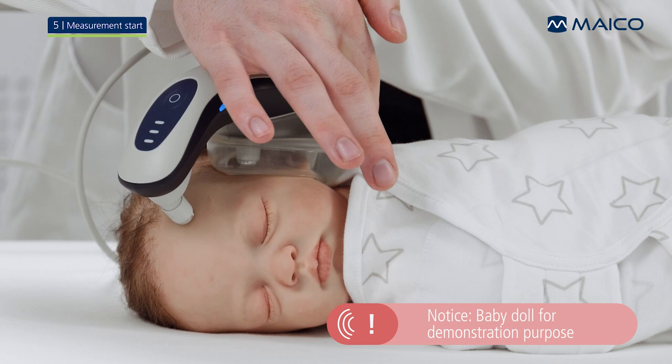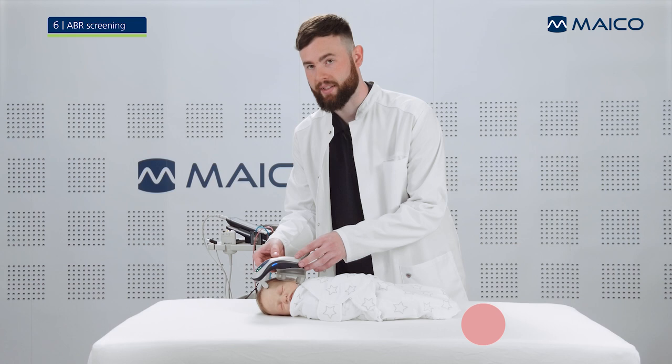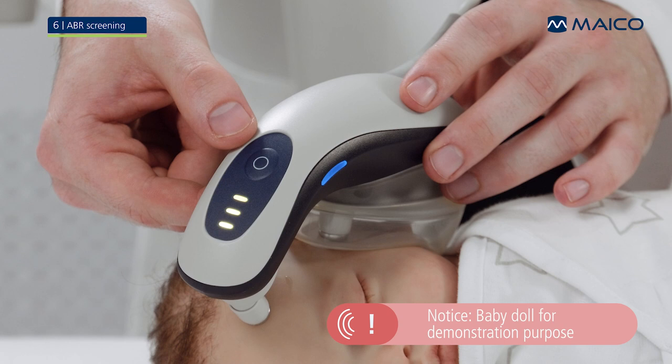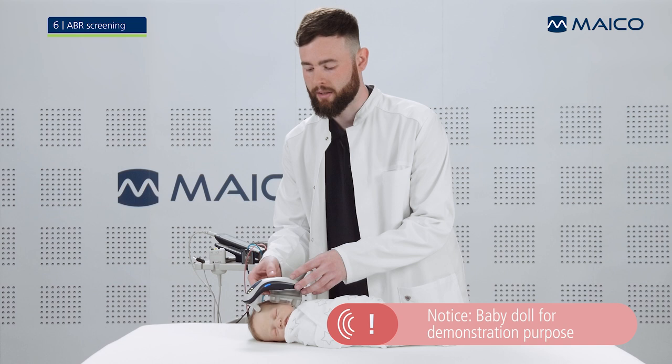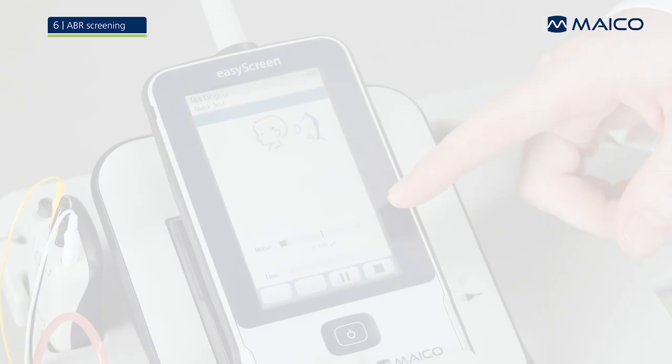Now press the button on the Baraphone to start a measurement. The state of the electrode contact to the skin will be shown on the three status LEDs of the Baraphone. If any of these LEDs is orange, you will need to improve the contact to the skin — possibly you will have to re-prep the skin. If all three measurement electrodes are green for a few seconds, the measurement will start automatically. The test progress will be displayed as a bar graph.